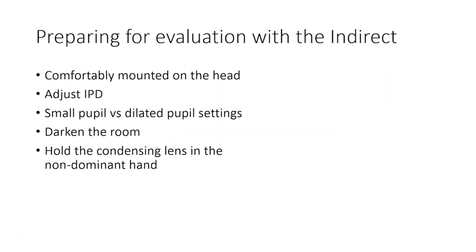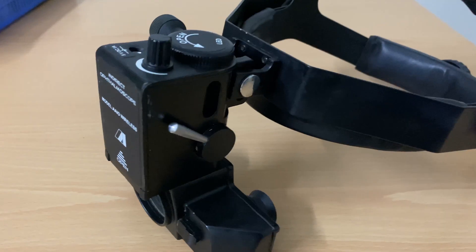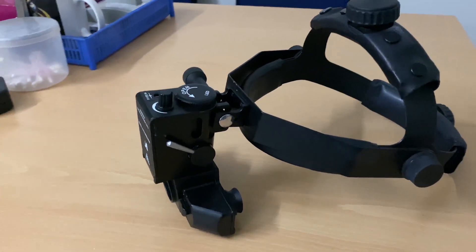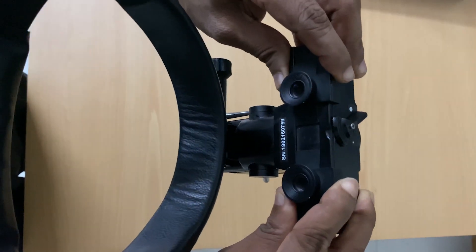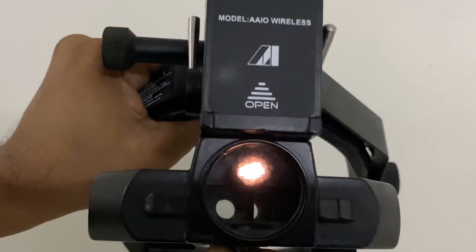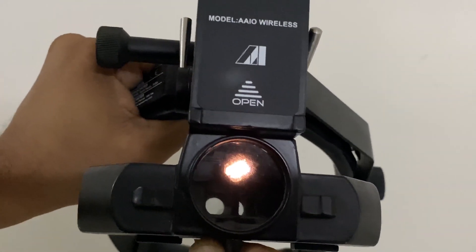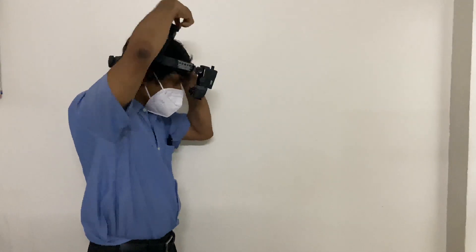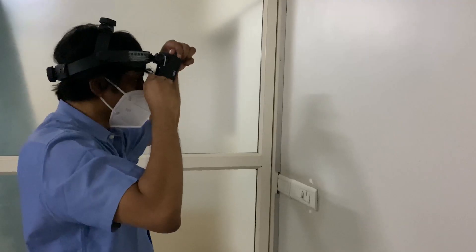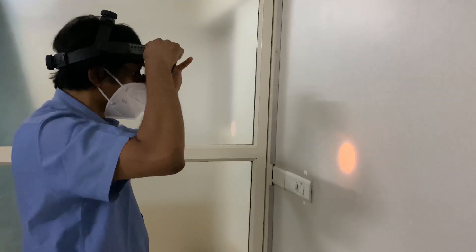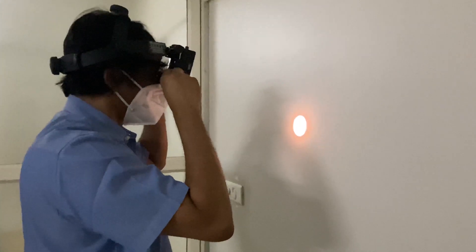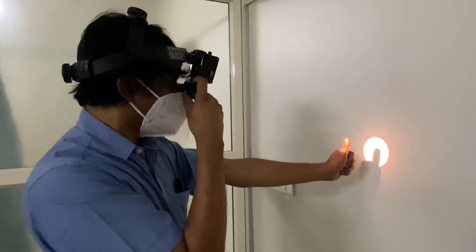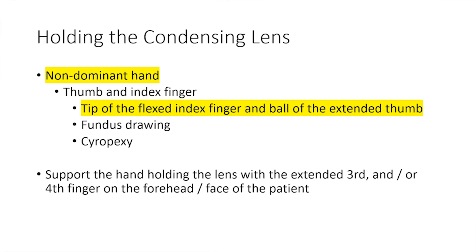Preparation is as important as the examination technique. The indirect ophthalmoscope should be mounted comfortably on the head with most of its weight resting on the top band rather than tightening the circumferential band. The IPD can be adjusted using the sliding eyepieces. Then switch on the indirect and shine the light onto the wall or the tip of the examiner's extended thumb to ensure the light centers in the field of view at that distance. One eye and then the other should be closed to check this, adjusting the interpupillary distance as needed.